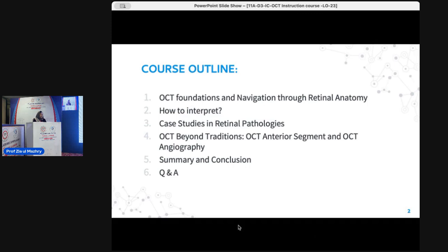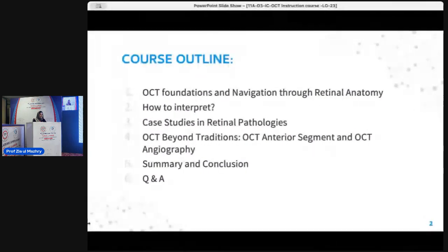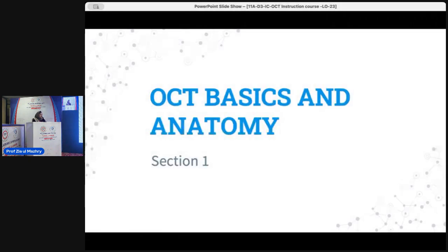And then we'll have a discussion about OCT beyond traditions, which will consist of a talk on OCT anterior segment and OCT angiography. And next we'll summarize the session with the help of question answers and conclusions. So I'll start the session from section 1, consisting of OCT basics and anatomy.